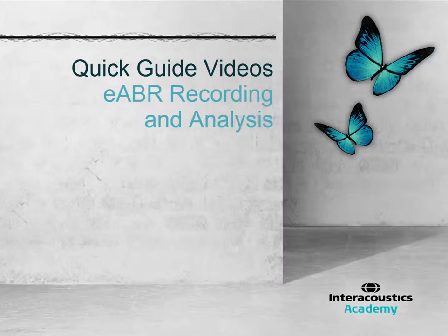This quick guide video explains how to record and analyse an eABR. The eABR procedure consists of 9 simple steps.